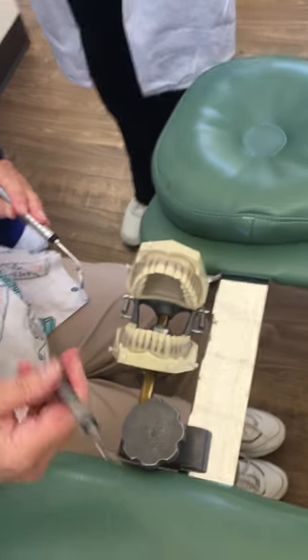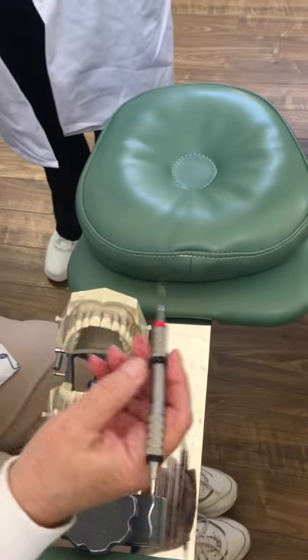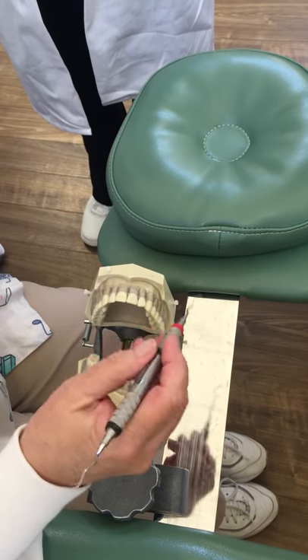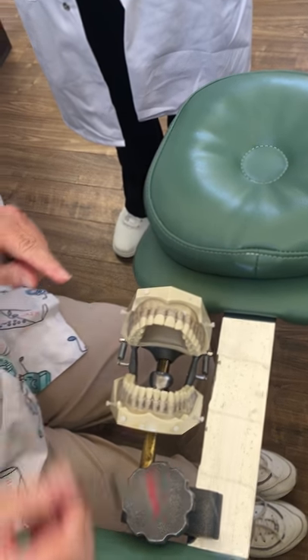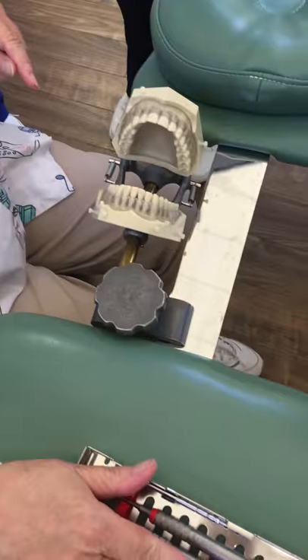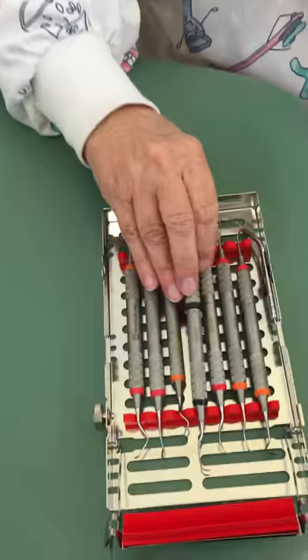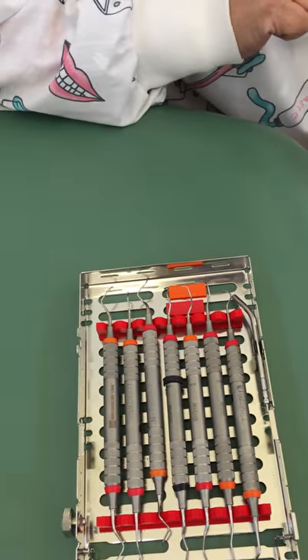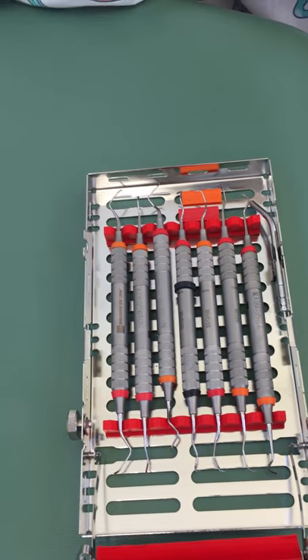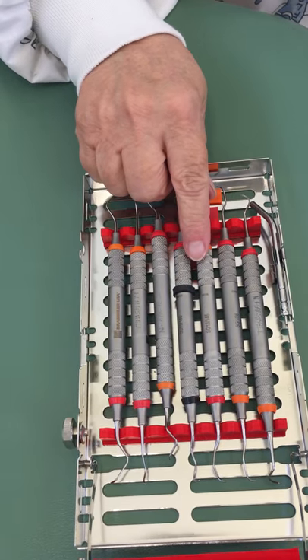While I'm in areas 3 and 4, I'm going to go ahead and do the mesials so I don't have to move. We're going to use the Gracie 1516. We've cheated a little bit here — we put a black band on it, because when you look at it in your cassette with all the bends going in the same direction, the 1516 and the 1314 look exactly the same.